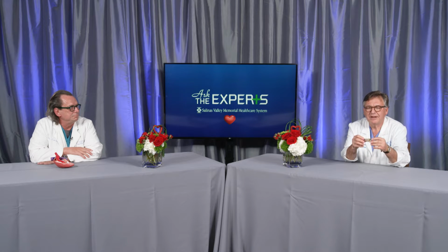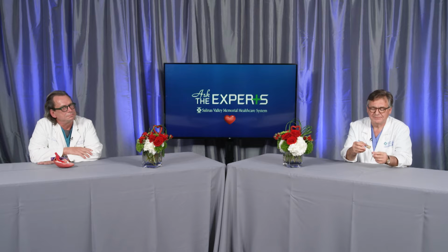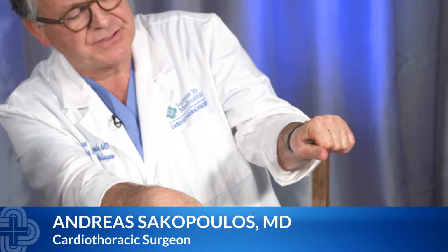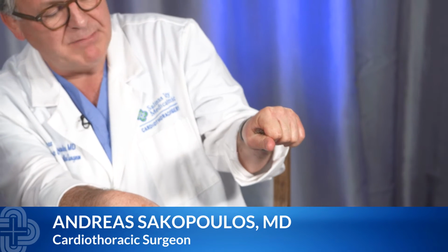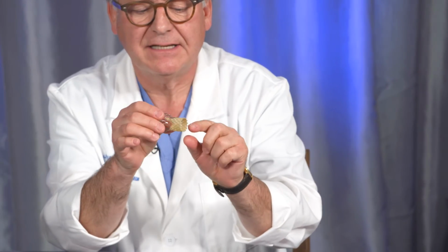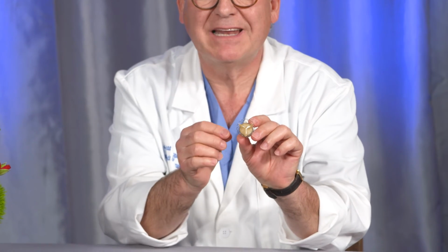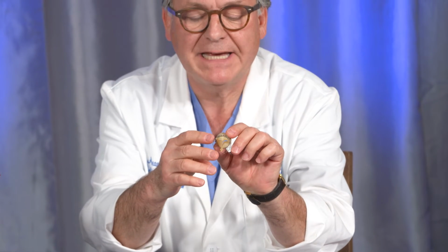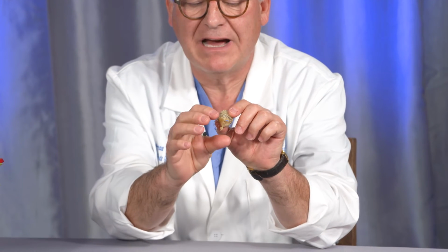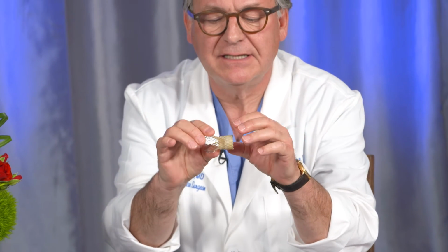Let me show a model of the transcatheter valve. You see, this is made out of a cage. It is an alloy that can be completely constricted, but this particular metal, which is mainly nitinol, will always want to go back to its original shape. And inside is porcine. It's made out of pericardium of a pig. And this is the exact same type of valve that we use with open heart surgery, except that rather than being on nitinol struts, it is on a sewing ring that we sew in place.